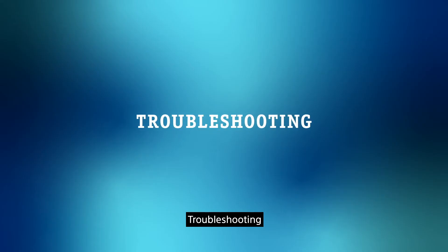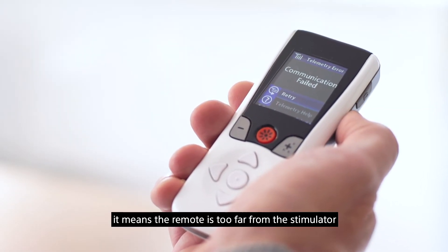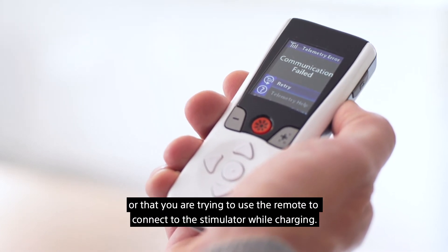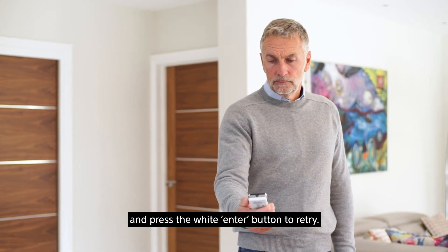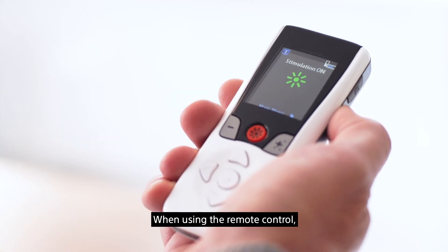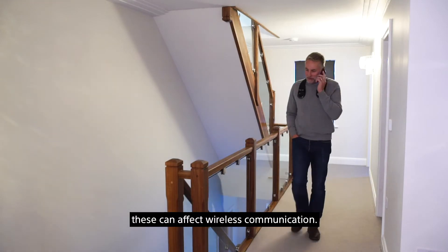If the message 'communication failed' appears on the screen, it means the remote is too far from the stimulator, or that you are trying to use the remote to connect while charging. Please move the remote control closer to the stimulator and press the white enter button to retry. When using the remote control, try to avoid sources of interference like computer screens and mobile phones, as these can affect wireless communication.